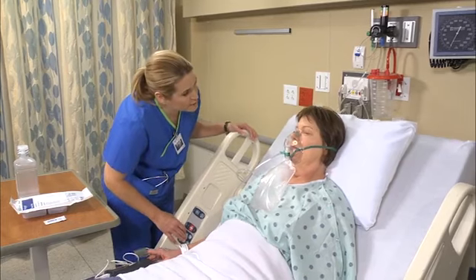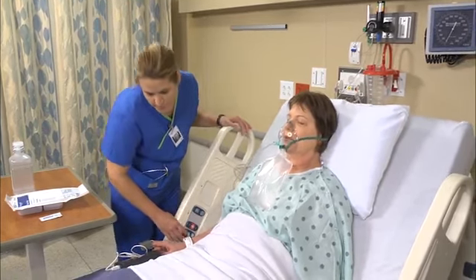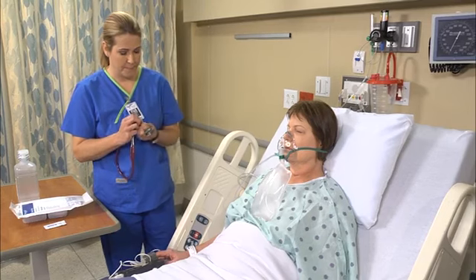Raise your head up a little bit so you can breathe a little bit better. Help the patient into the semi-Fowler's position, or help her sit up. Put on a mask, goggles, and face shield if splashing is likely.